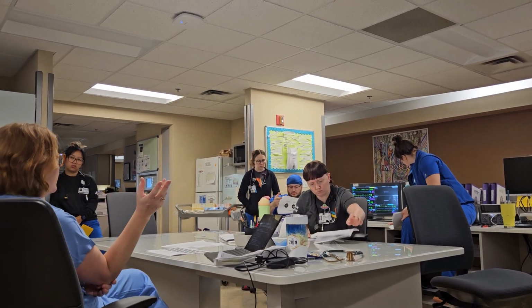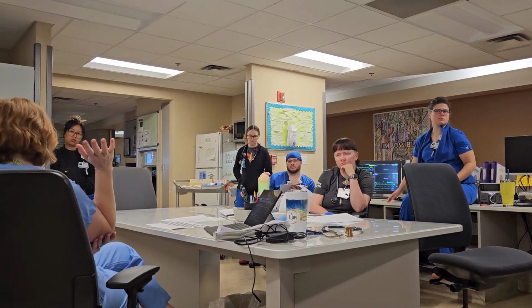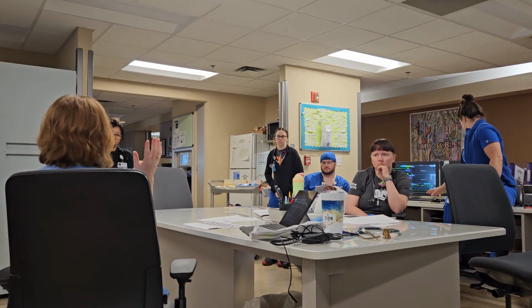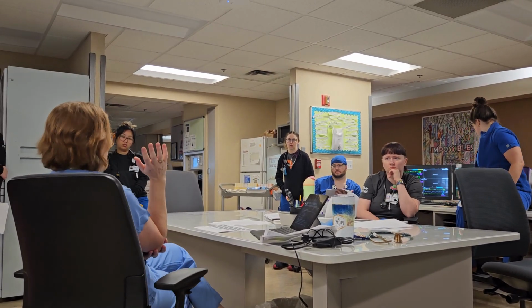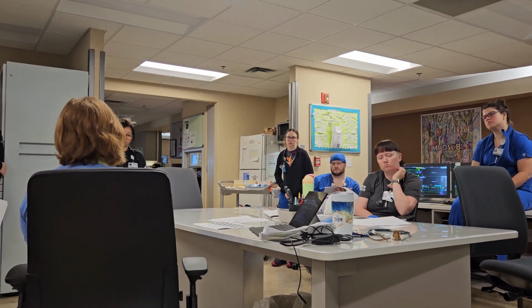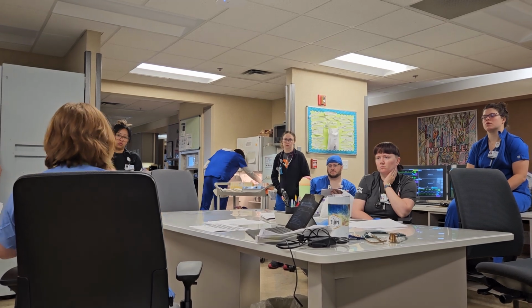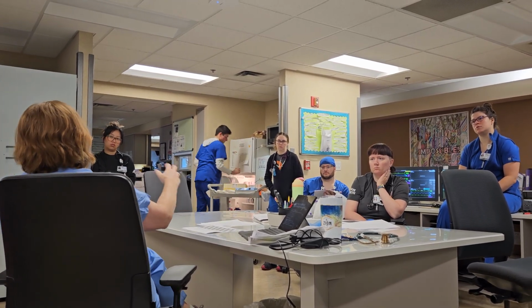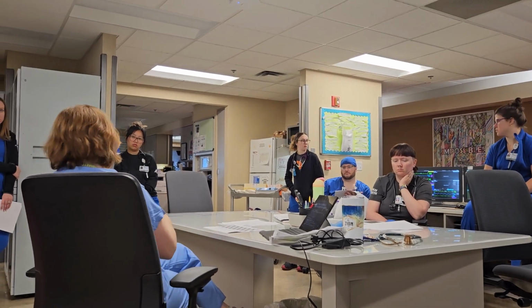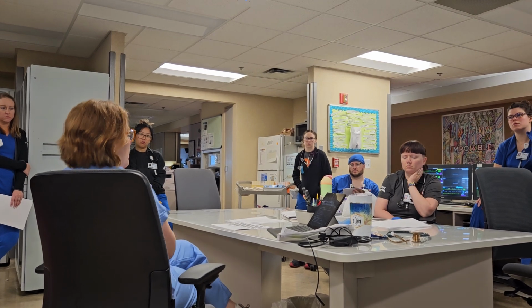There was a huge study that came out several years ago called ARDSNet. It was a humongous trial on ARDS patients that proved that lower tidal volumes by far improves outcomes and reduces risk for barotrauma and allows for permissive hypercapnia. Permissive hypercapnia is what allows us to adjust the ventilators to help get patients extubated. If we're over-breathing them all of the time and giving them a respiratory alkalosis, we have a very difficult time backing off on our vent settings to get people off the vent.